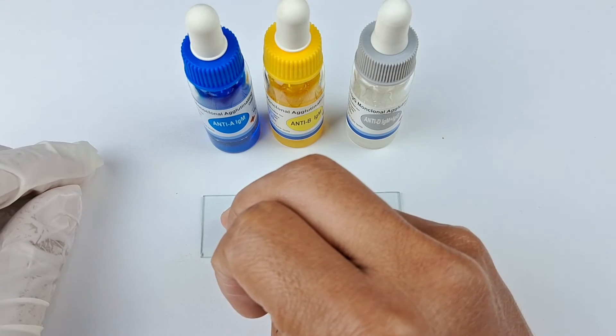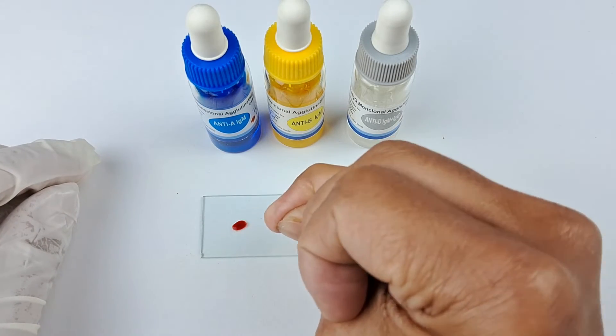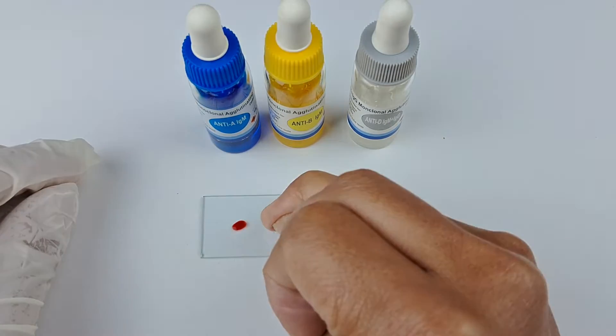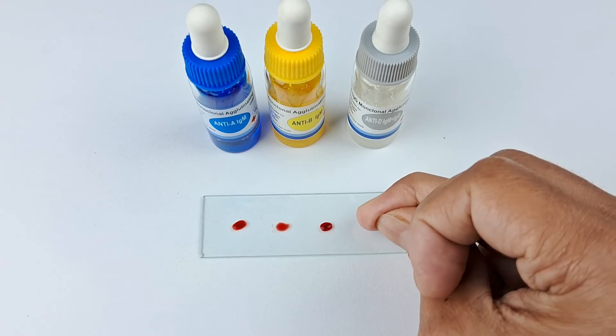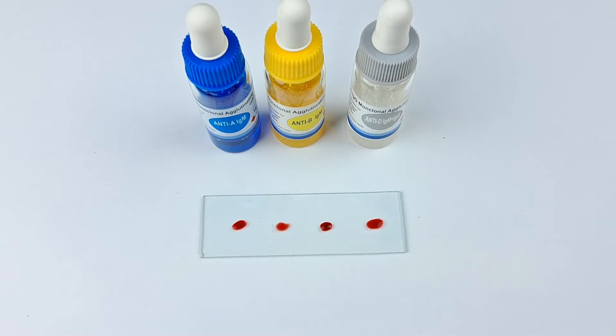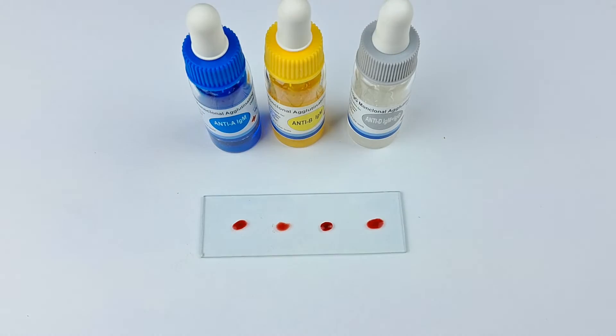Now gently place four drops of blood on the glass slide at more or less equal distances from each other. Do not place the two corner drops too close to the edges of the slide as it might pose some inconvenience when mixing later with the mixing stick.